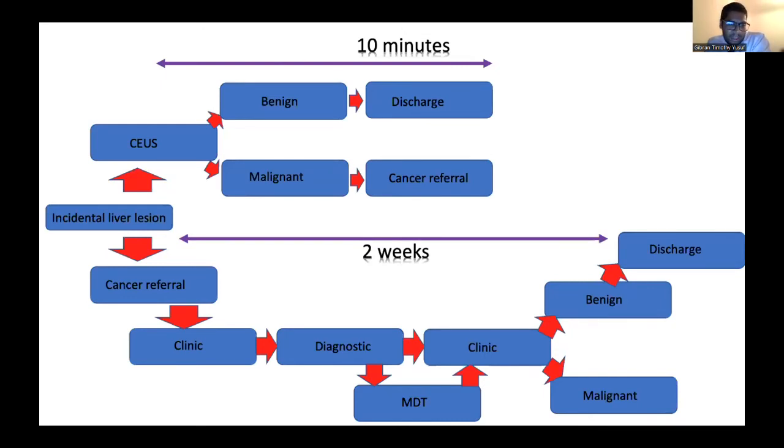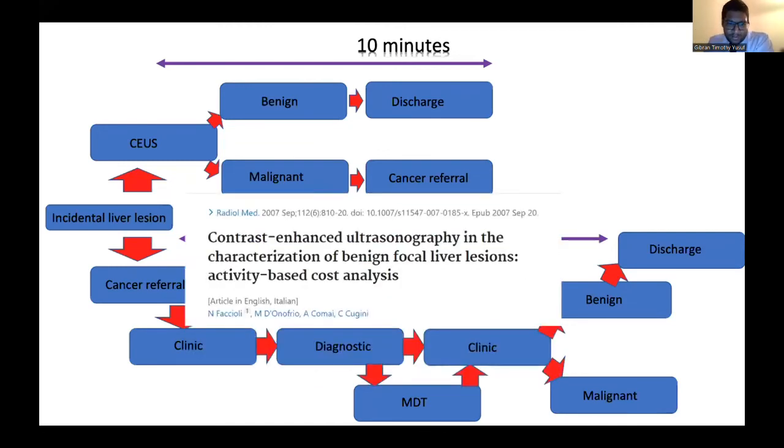It could have been delayed, say something happened, say the CT scanner broke, the usual problems. Instead, you can do a contrast enhanced ultrasound in the room, which is what we did, and we were able to discharge them without even reaching the hepatology team. So I think this is a true reflection of where this is useful.